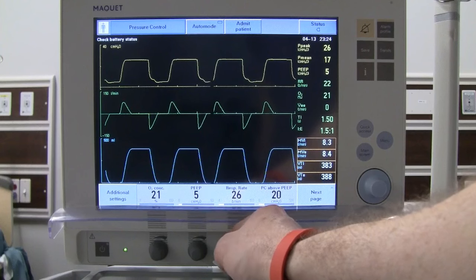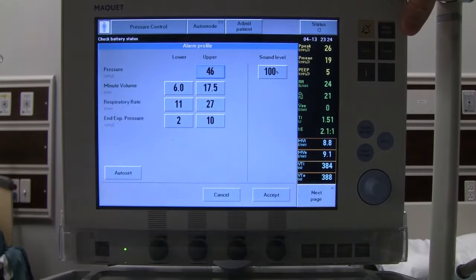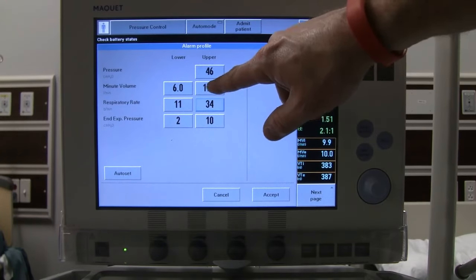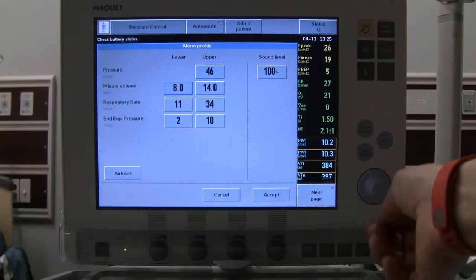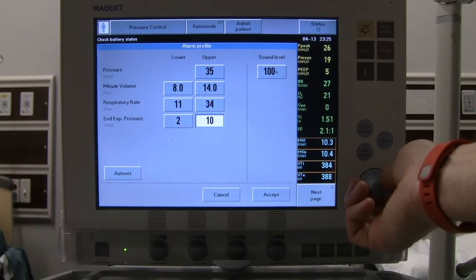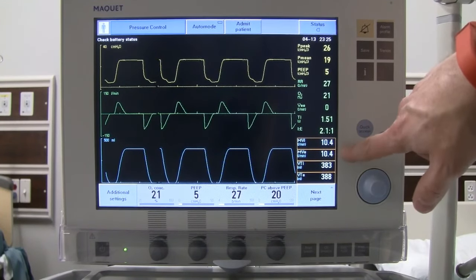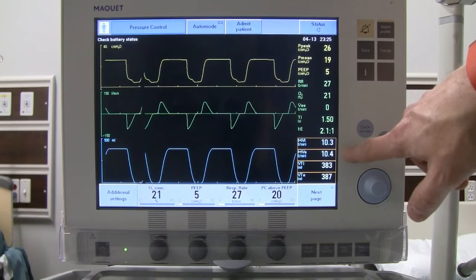Going up to a rate of 27, we need to readjust alarms: upper rate limit to 34, target minute ventilation of 10 L/min, so upper at 14 and lower at 8. Since we've brought pressure down to 26, set the high pressure alarm at 35. PEEP alarms stay as before. After accepting, we now have a much smaller tidal volume but are back near the 10 L/min minute ventilation target. We may be slightly hyperventilating at a little over 10 L/min. That covers pressure control.